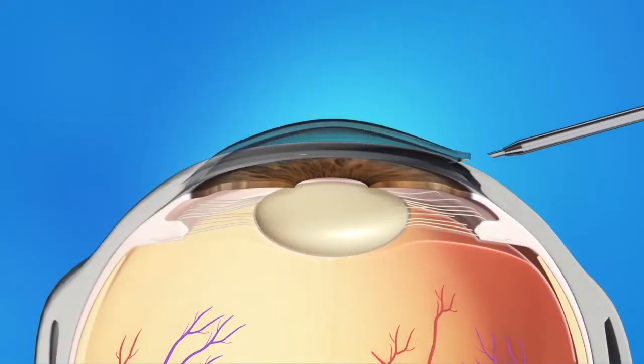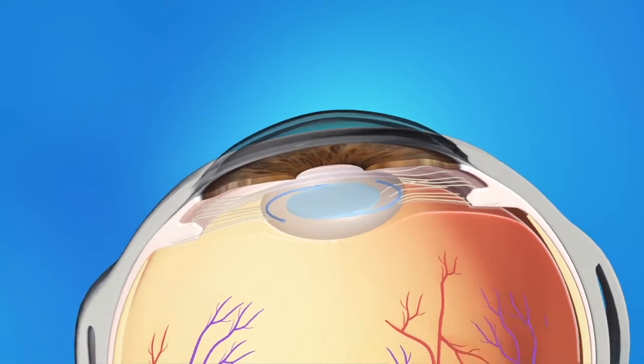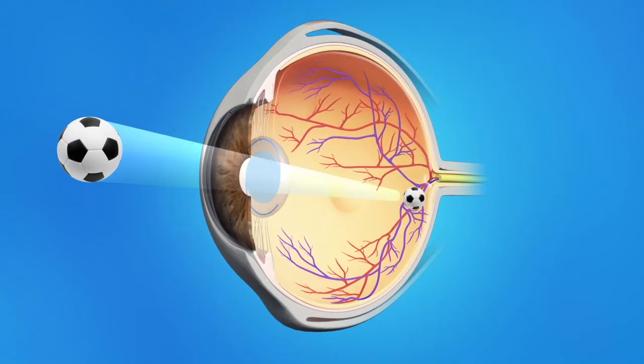Cataract surgery is done at our outpatient surgical center about a mile from our office. During surgery, patients are under a twilight-like anesthesia. They won't really remember too much of what's happening. The surgeon will enter the eye, remove the cataract, place in a clear lens, and that's it. Patients will return to the office the next day. The vision will generally be cloudy.